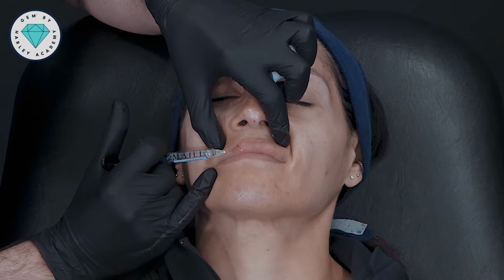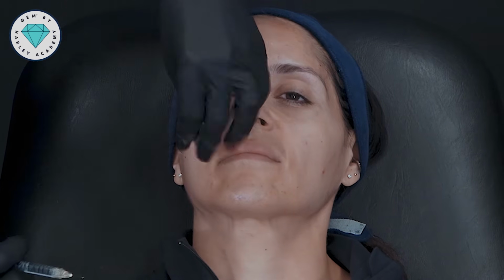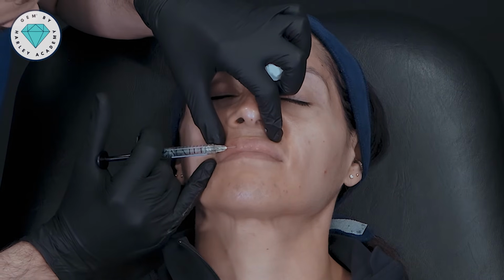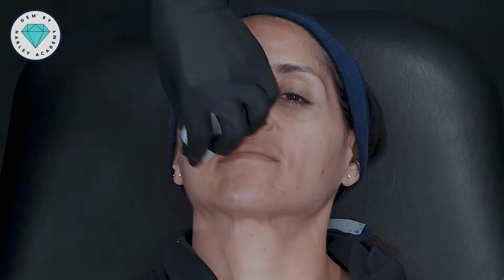When I started doing this, my worry was that the lips would just get to feel and look very lumpy with these boluses. But so long as you're respecting those compartments and, like you say, using a product on a softer, medium kind of G prime, actually, you don't get any lumps at all. You started doing this in your practice as well, mate? Yeah.